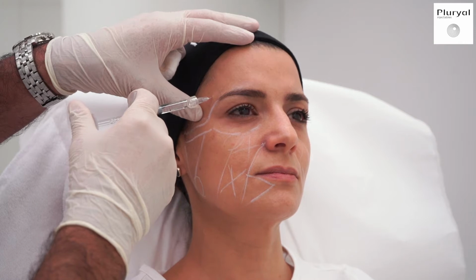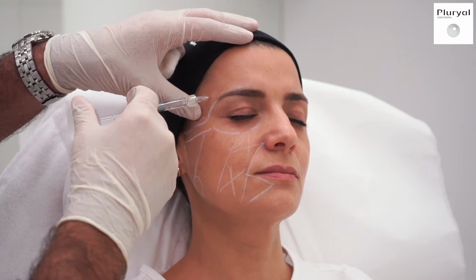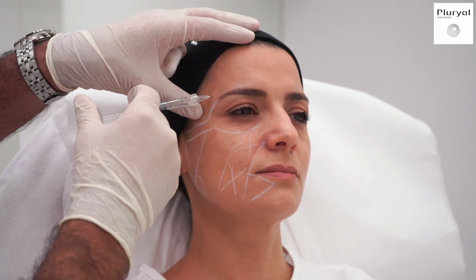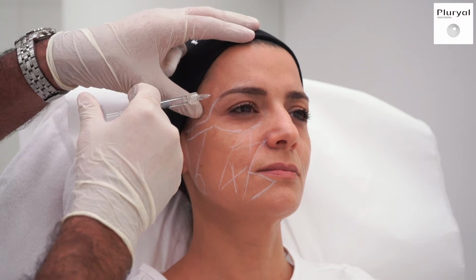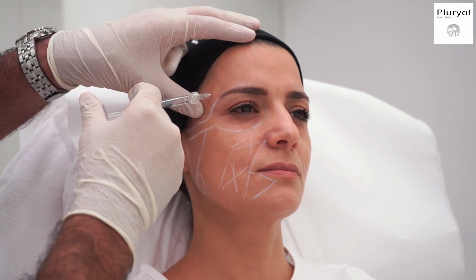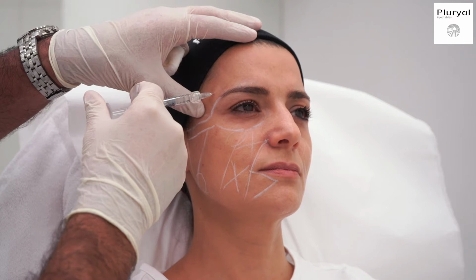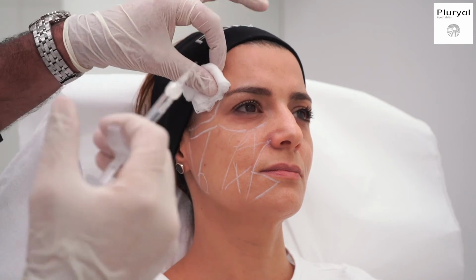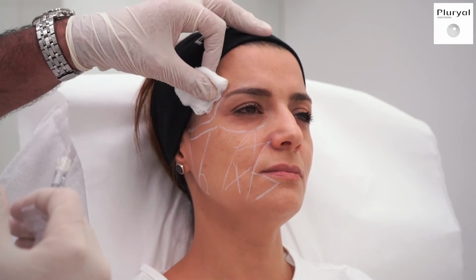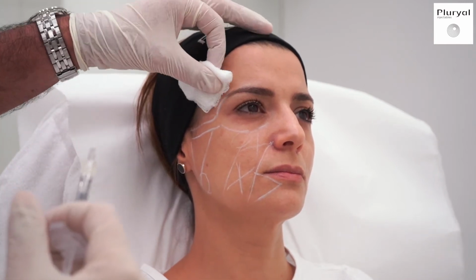The Pluryal Contour Lidocaine is one of my favorite products, if not the favorite, because it has a high G' and a high lifting capacity. Whenever you inject, always inject slowly so that the patient doesn't feel any pain. I used here 0.5. I always use the minimum of 0.5 for the temporal area.